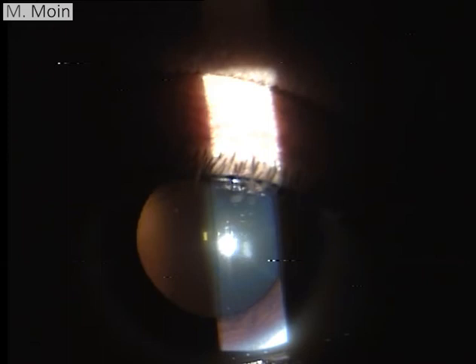Welcome to this video in which I'm going to show you the examination of the posterior segment using a superfield lens. In slit lamp examination, the first thing you want to see in this patient is the disc. This is the optic disc which you see, so cup-disc ratio is about 0.2.